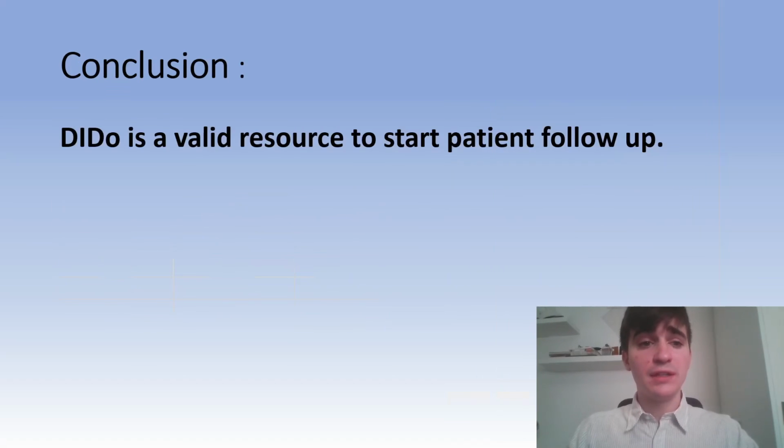So we conclude that DIDO is a valid resource to start patient follow-up if the peak skin dose reaches a certain value.